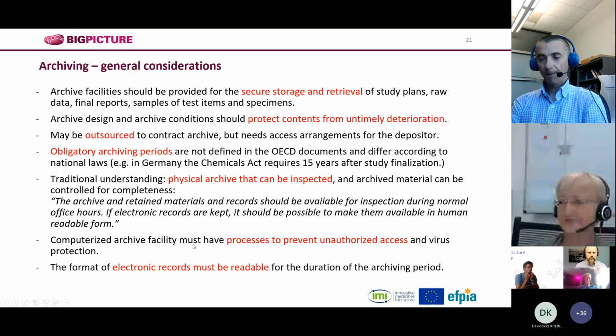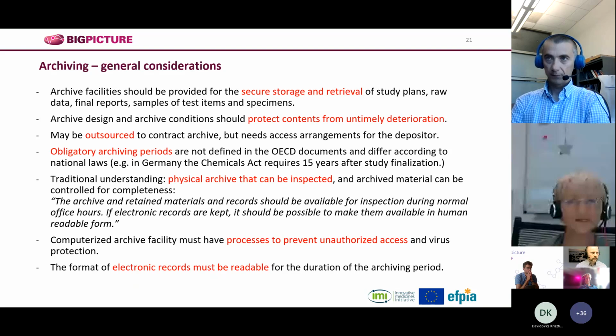Computerized archive facility must have processes to prevent unauthorized access. And finally, again, the format of electronic records must be readable for the duration of the archiving period, which can be a true challenge.